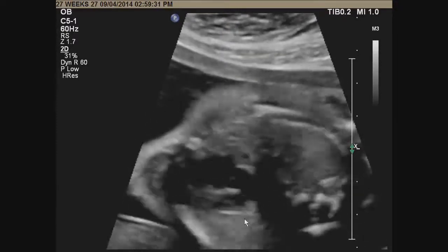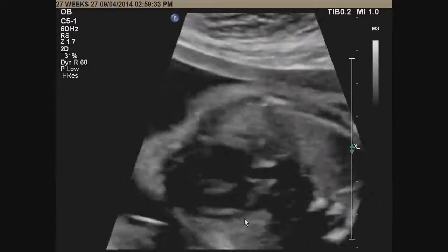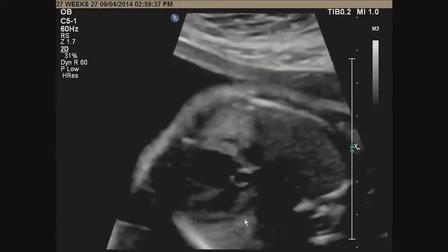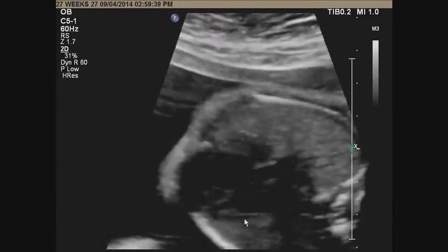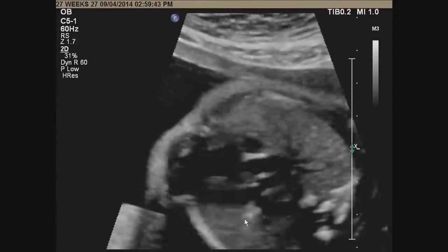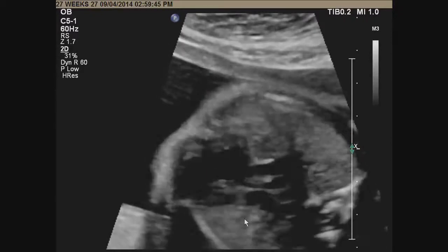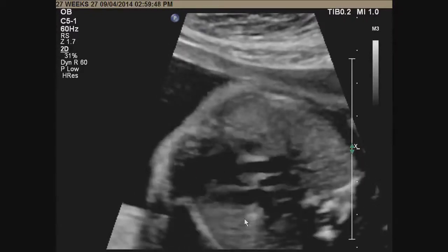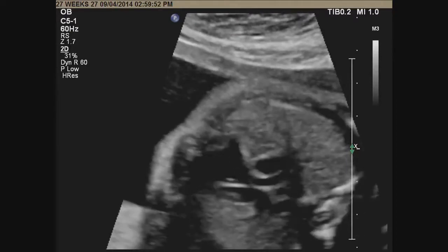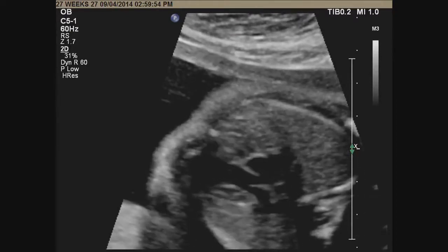So I'm going to come up here a little bit, and let me get my hand on the freeze. There are several axial views that you do coming up from the 5-chamber view. The first one is the 3-vessel view, where you see the aorta and the pulmonary artery dividing into the right pulmonary artery that goes under the aorta, and the left pulmonary artery at this level.